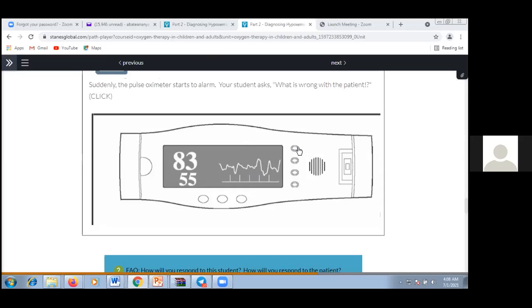Okay, let me see the chat box now. I think pulse oximetry placement is inappropriate. Okay. The waveform is not correct. The probe may be loosely attached, not attached well. It could be artifacts, maybe cardiac rhythm abnormality. Okay, I think you have tried well. Excellent.